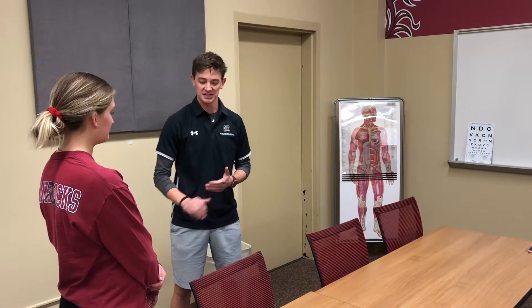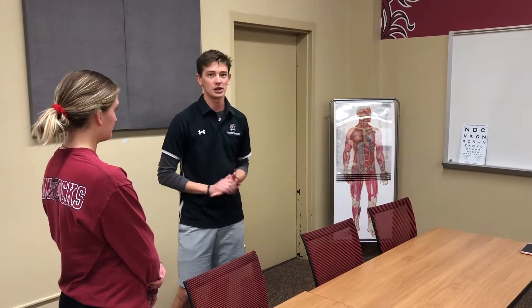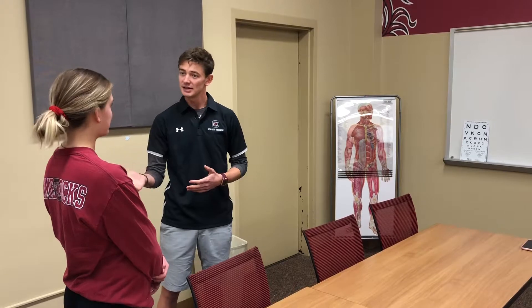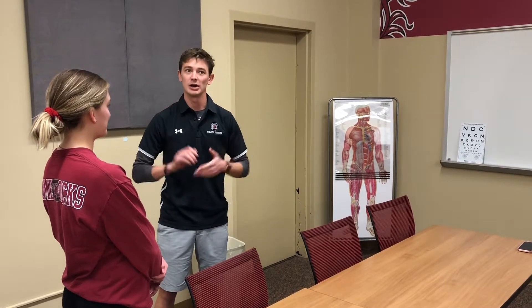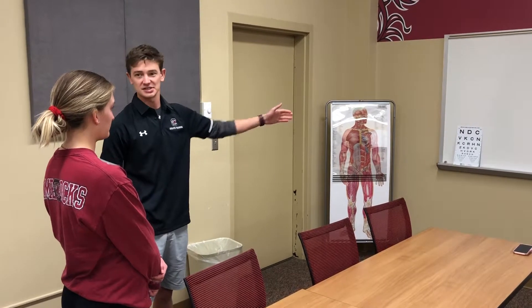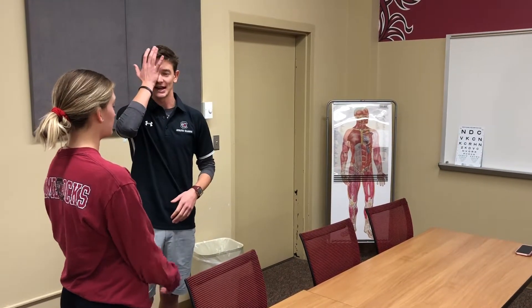When performing this exam, make sure the patient is standing about 20 feet away from the chart. You're going to ask if they wear any corrective lenses like contacts or glasses — if they don't, they won't need them; if they do, you're going to have them put them on. Then instruct the patient to read the lowest line they're able to see, first starting with covering the right eye.